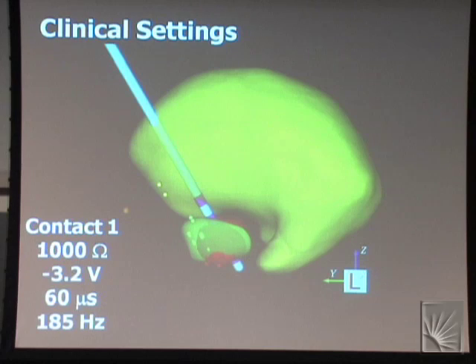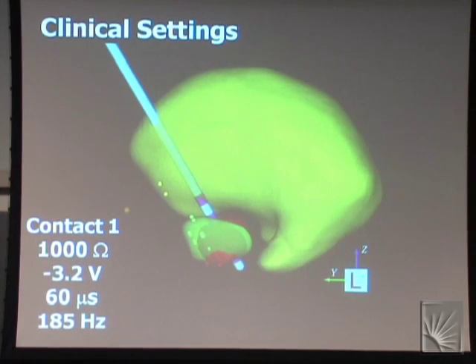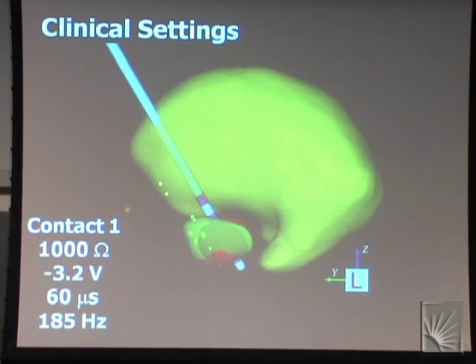So the basal ganglia isn't only motor, it's also cognitive and limbic, or associative and limbic, which kind of make up cognitive activities. And so Jay's hypothesis was that patients who are having these cognitive declines are having them not because of the DBS per se, but because of DBS spreading into these cognitive circuits in addition to the motor circuits that we're trying to activate.